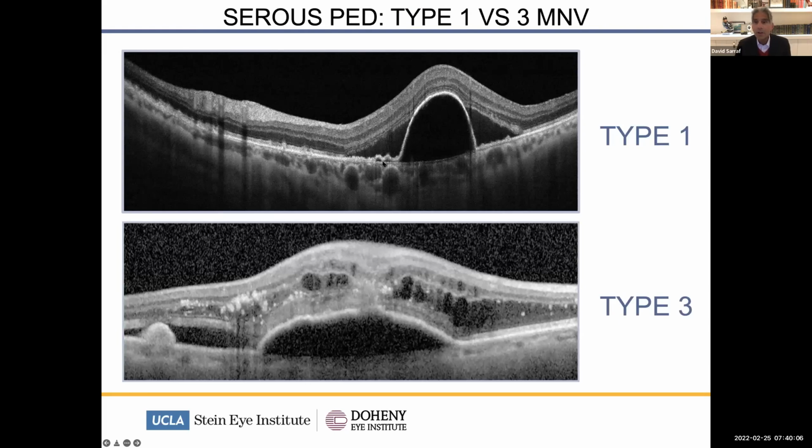In macular degeneration, specifically, we have two forms of neovascularization, actually three forms: type 1, type 2, and type 3 neovascularization. Type 1 and type 2 originate from the choroid, and type 3 originates from the retina. And we can see in these cases the presence of subretinal fluid as an indicator of neovascular activity, as well as intraretinal fluid and a pigment epithelial detachment, in this case associated with type 3 neovascularization.